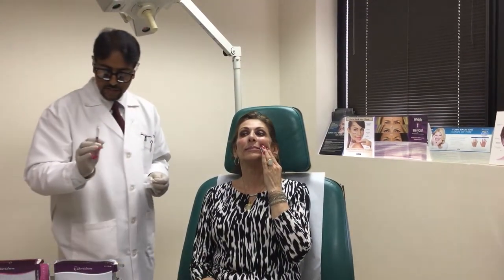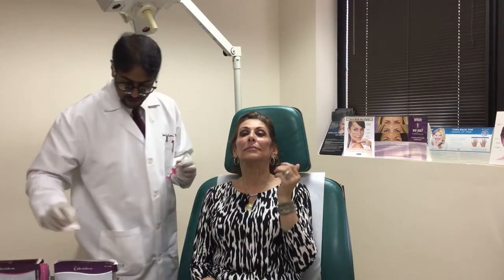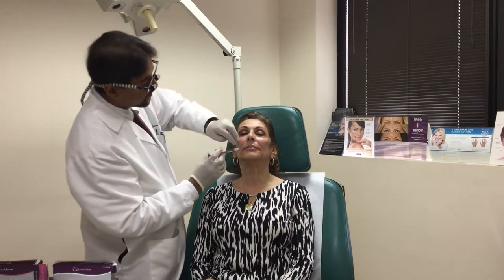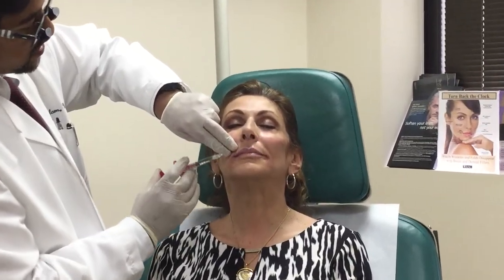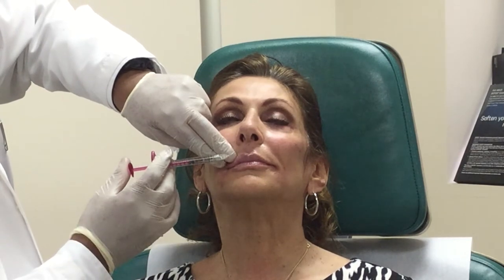This is also Volbella — a 0.5cc syringe of it. You can use the product to either augment the lips, or just augment the white roll, or both. You can also augment the philtrum column, which people lose some of the prominence of over time. It really depends on the discussion with the individual patient. I find lips, more than other areas, patients are very specific about how they want their lips to look — especially where we are, patients tend to be conservative and don't want overly augmented lips like some areas of the country.